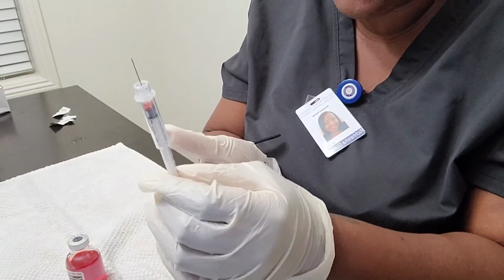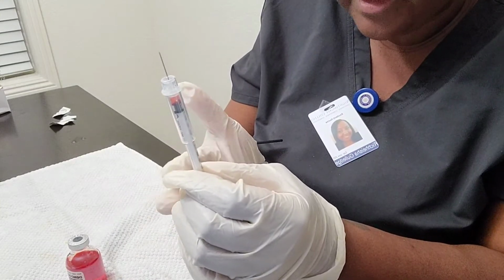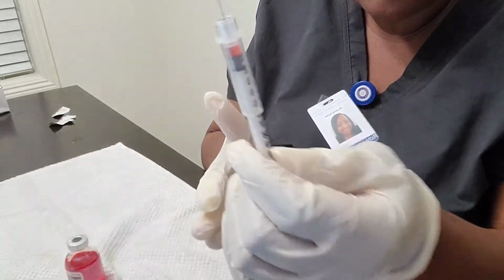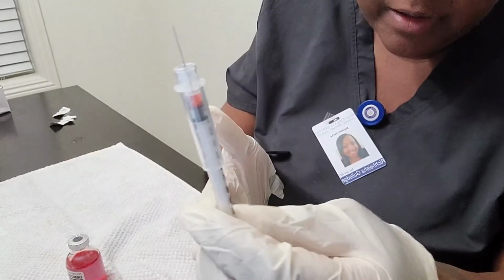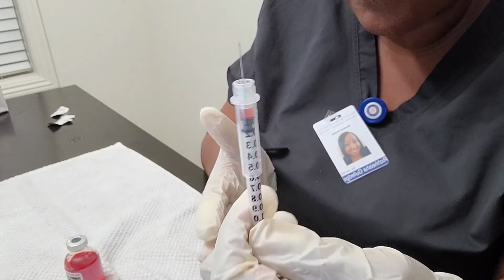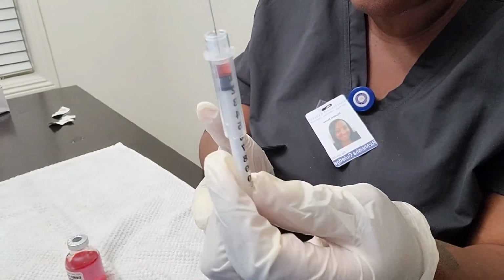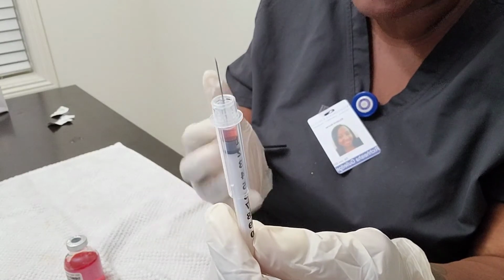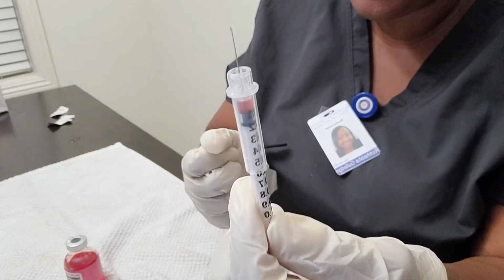Okay, so then I will go ahead and just verify again the right dose that's inside, which is 0.1, and also verify that I have the correct medication and the correct dose.